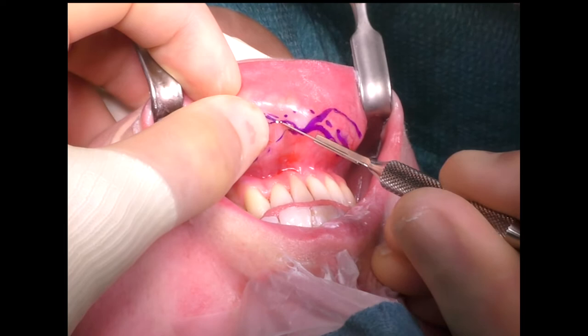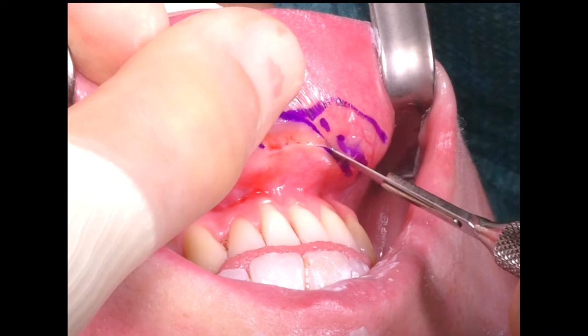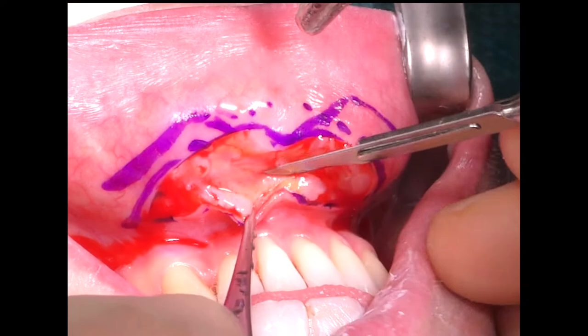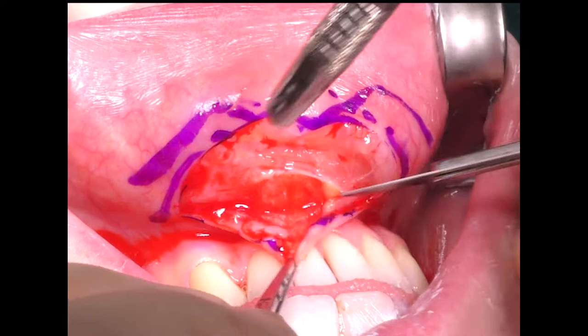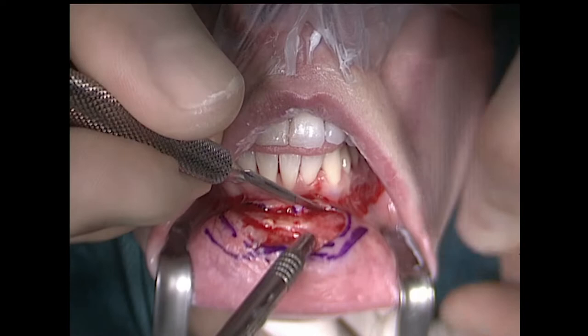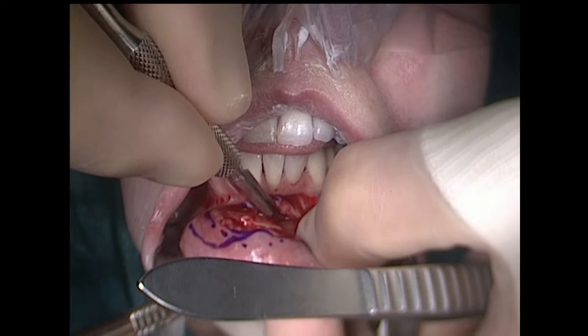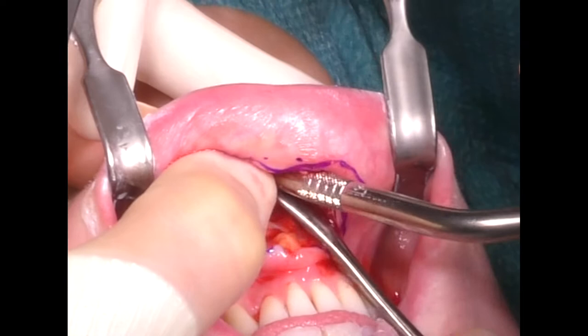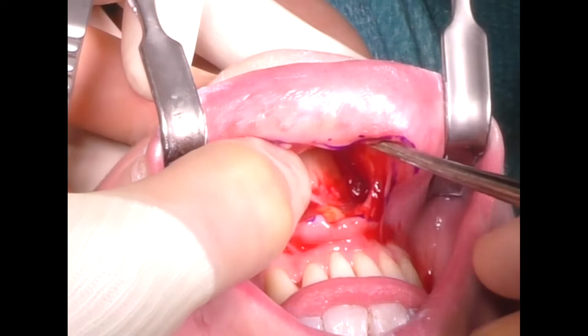A blade 15 cuts through the mucous membrane and exposes the salivary glands. A sharp dissection here, taking care of any small nerve branches — you can also use a Metzenbaum scissors, of course. Once approaching the mentalis muscle, I make a straight cut through the muscles, leaving a stump attached to the bone, the origin. And with a periosteal elevator, I dissect it down in the midline.